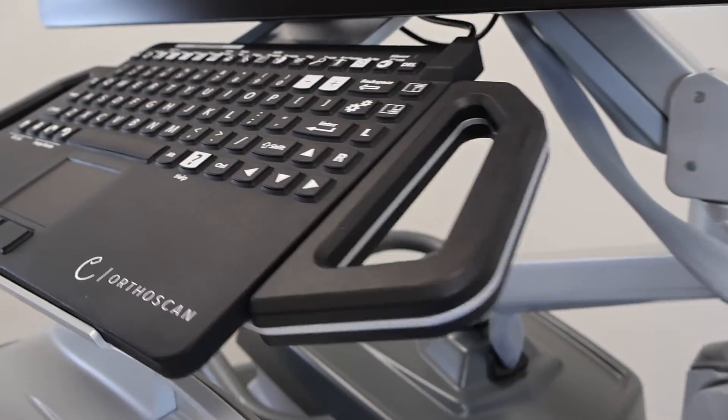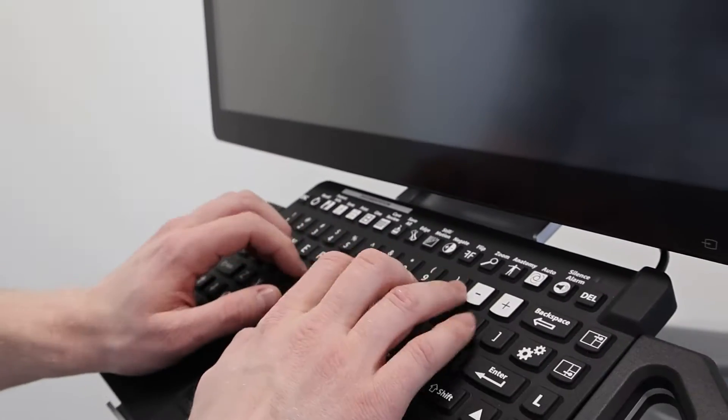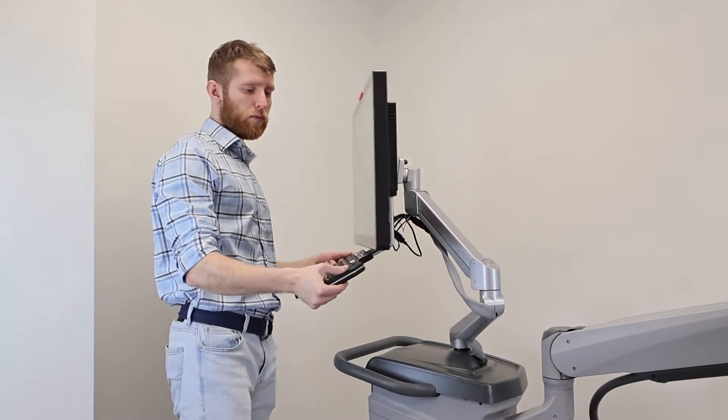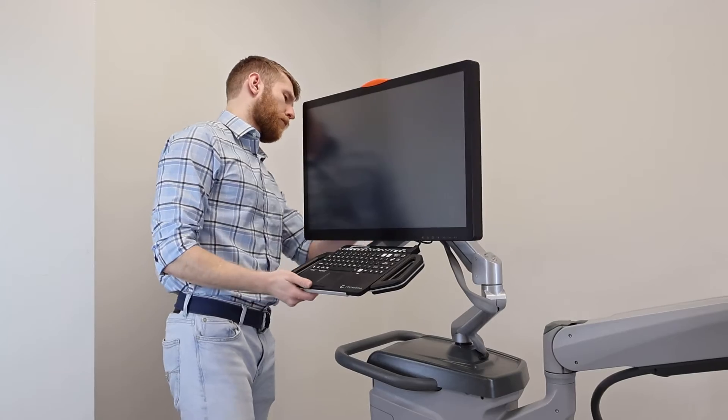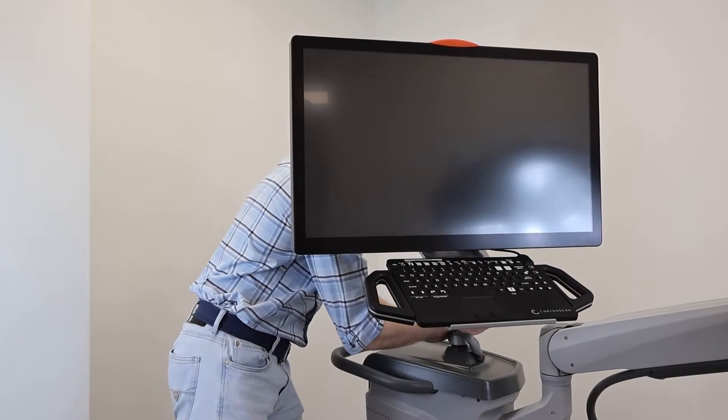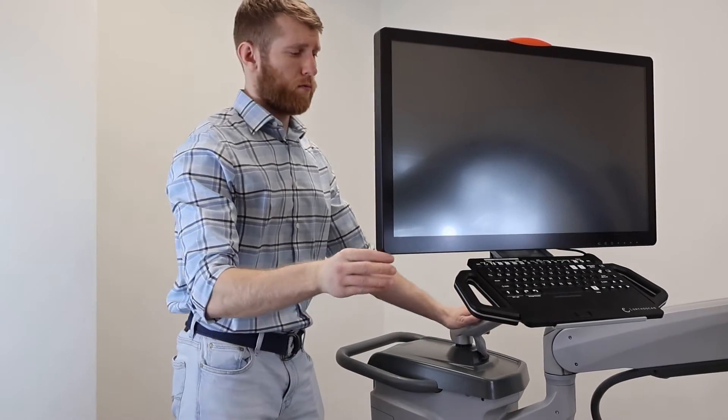It has a lightweight frame and a bright 27-inch monitor with a 13 by 13-inch live image in a 1920 by 1080 screen resolution. This monitor has an advanced touchscreen interface with anatomical selections and pediatric software.